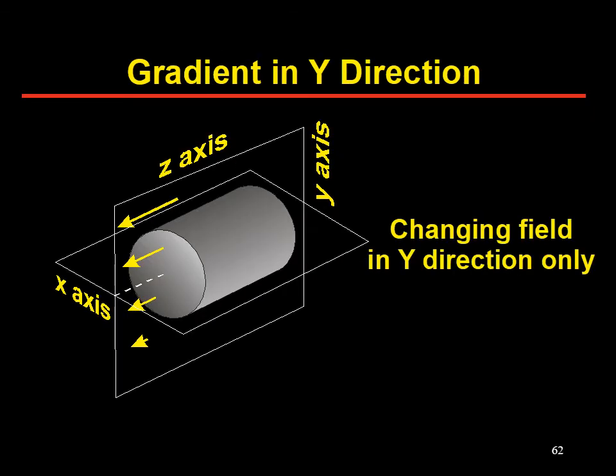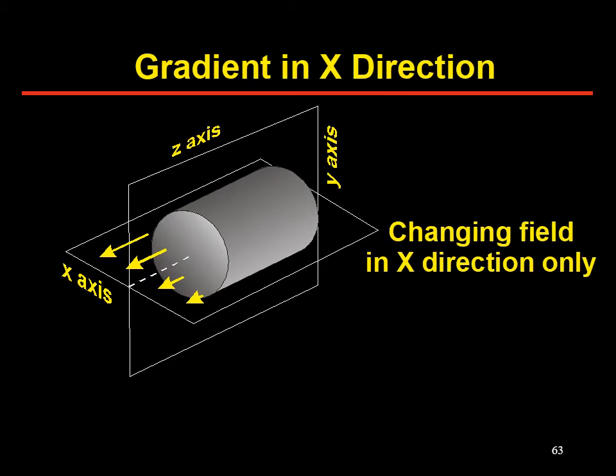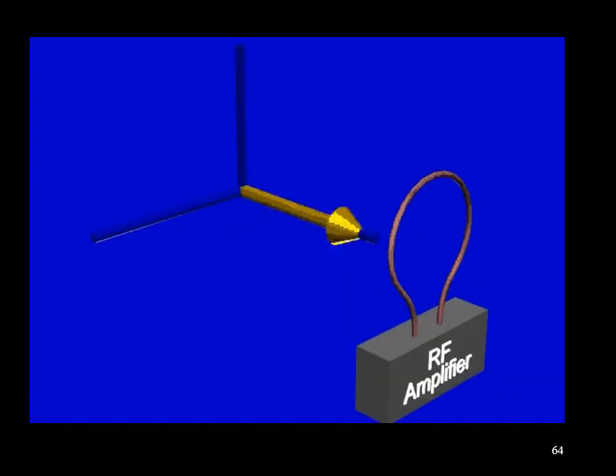In most textbooks, when spatial localization is described, it is described as a two-step process, first by changing the gradient in the y direction, and then changing the gradient in the x direction. The same process will be illustrated in this talk, but in a slightly different manner, which I think will make the process more intuitively obvious.